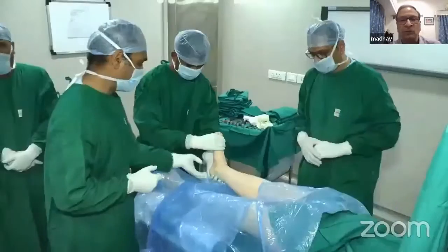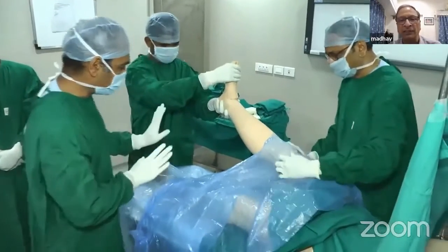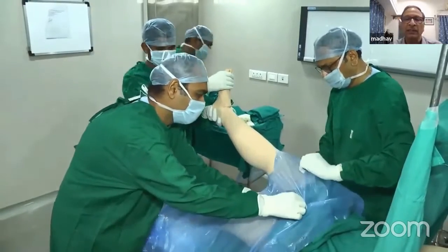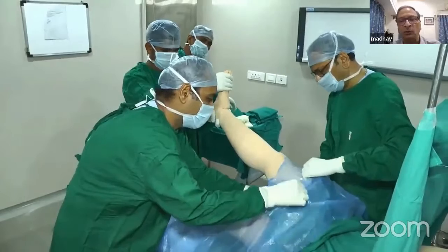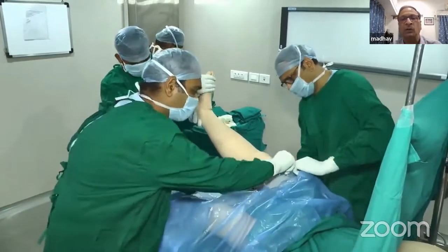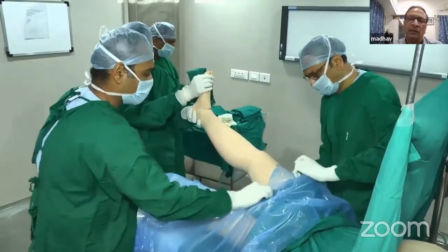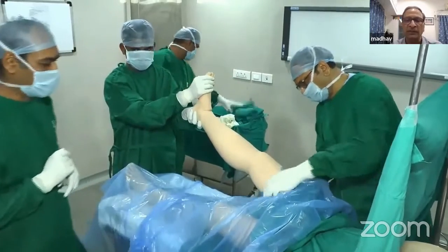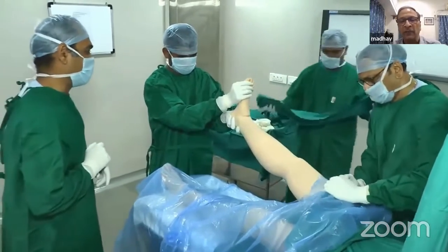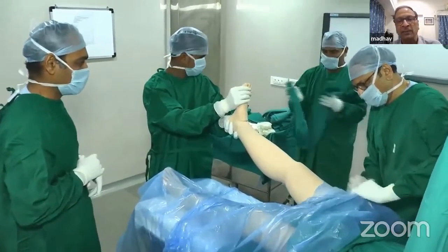Here I'm showing the video for below-knee surgery draping — you go only up to the knee. If you want to keep the knee open, or you're operating on the lower thigh or knee, you keep pulling the plastic sheet; it goes on tearing and goes right up to the upper third of the thigh where the tourniquet is applied.